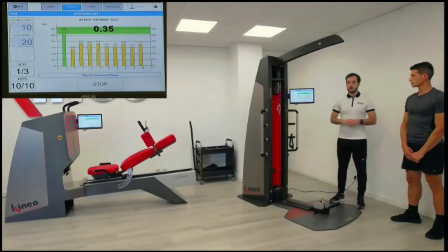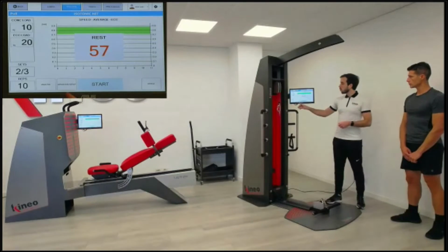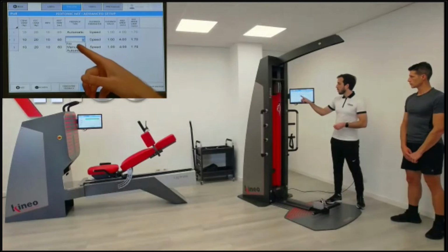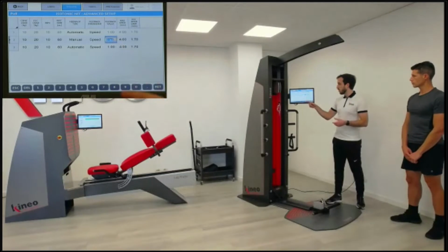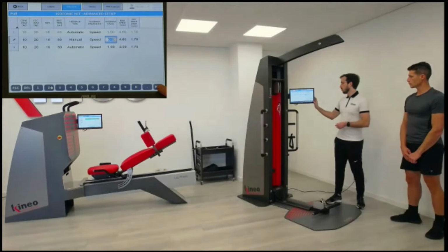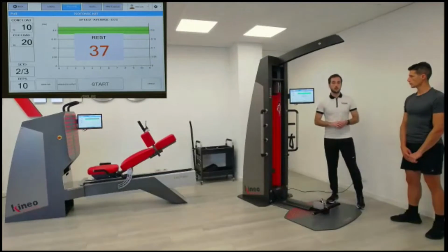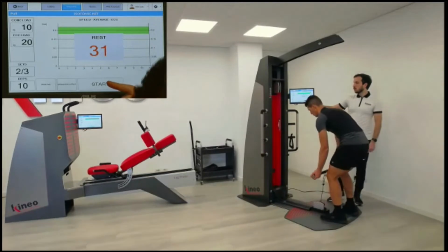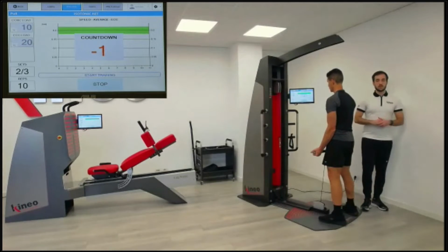This is an automatic mode. We can also select a target for him. So what we can do is making manual biofeedback and taking the speed for the next series at 0.2 meter per second. Now, as you can see, the green line is set as 0.2, which means that now Damiano, please, will make sure to follow the instructions of Kineo to set each execution on the green line.